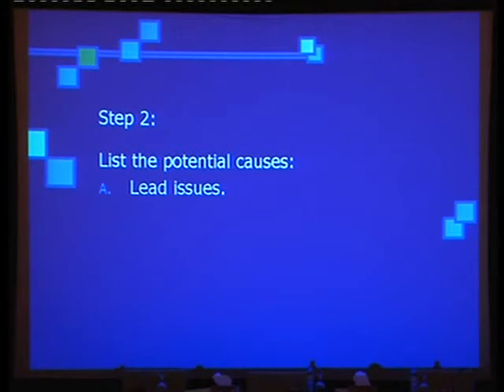So lead problems are the majority of the problems of the pacemaker, more than 55% to 60% from the leads. So what's the problem with the lead? Is it an early problem or a late problem? Early problems usually happen after the implantation. So the lead may be dislodged, and the dislodgement can be assessed under radiographic views.